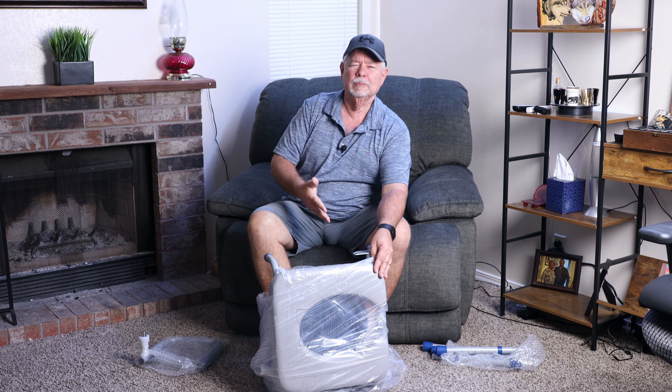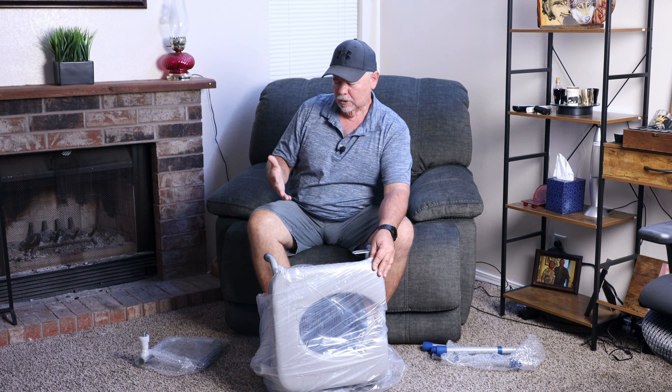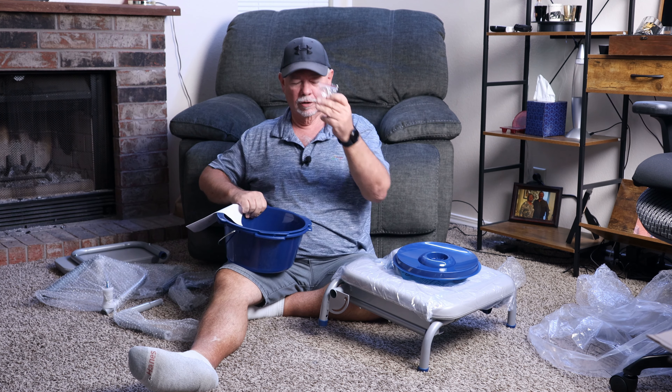Let's speed it up a little bit so you won't get too bored — slow enough to where you can see it, but fast enough we're not going to get too bored. I'm going to move down to the floor so we can work on this a little easier. Maybe some instructions are in here. The instructions are in the pot, along with an Allen wrench.